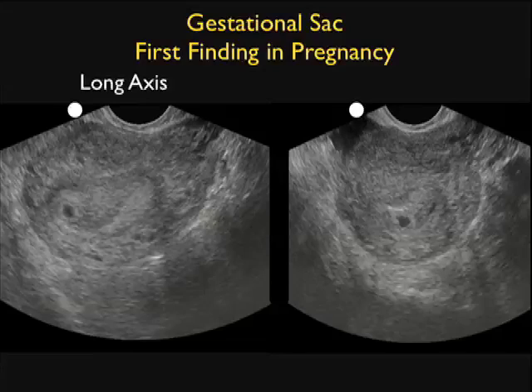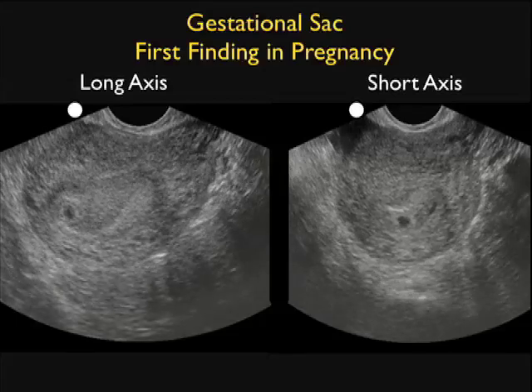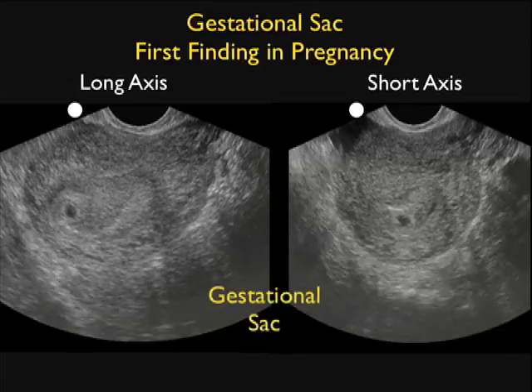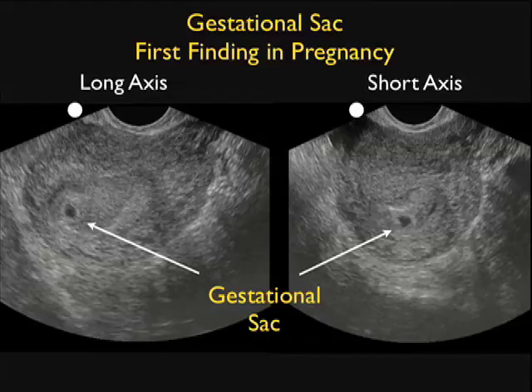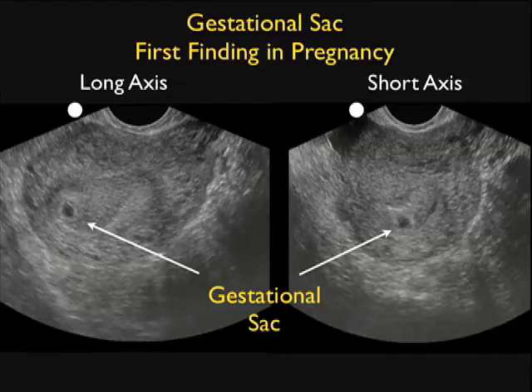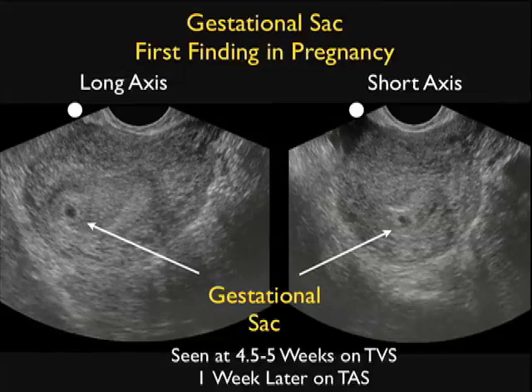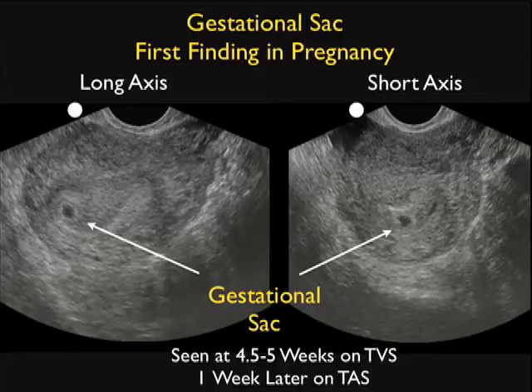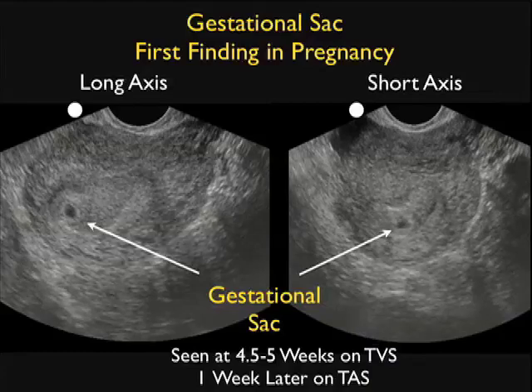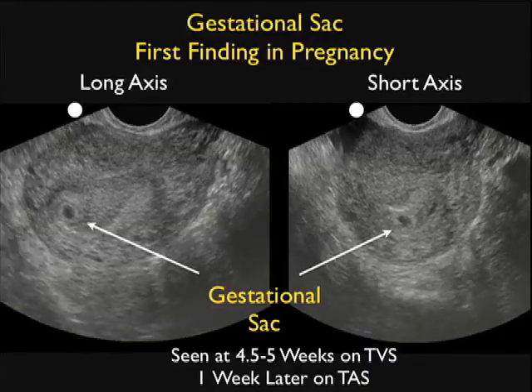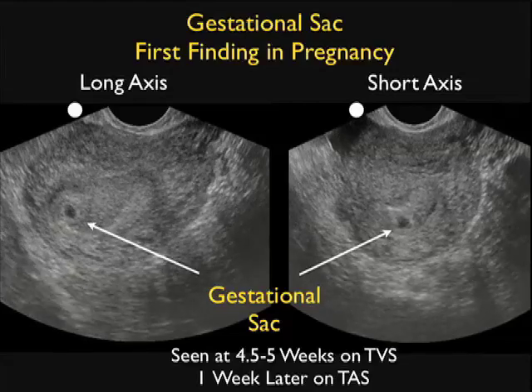Here are two video clips showing the gestational sac in long axis and short axis views. We see a very small diameter gestational sac in both orientations. This can also be seen with a pseudo-gestational sac of ectopic pregnancy, so a small gestational sac like this is in no way diagnostic of an intrauterine pregnancy for the emergency physician sonographer. Remember, the gestational sac is seen at about 4.5 to 5 weeks on transvaginal sonography and about a week later on transabdominal sonography.